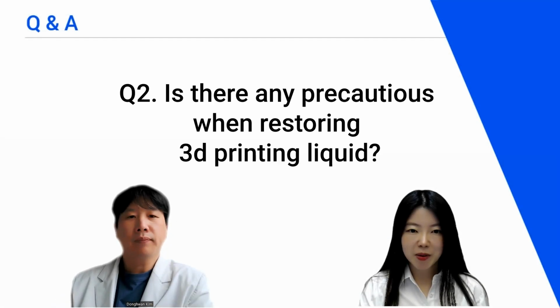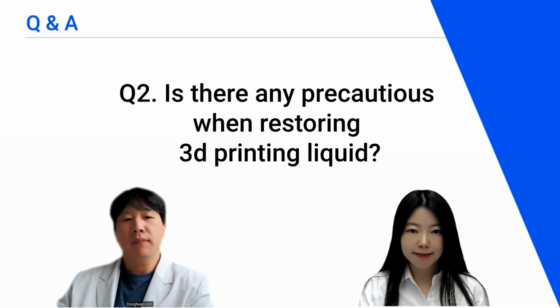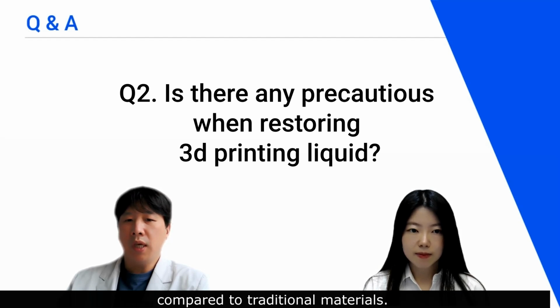Okay, so question number 2. Are there any precautions when restoring with 3D printing resin? When restoring with 3D printing resin, especially those intended for dental prostheses, it's important to handle them with care due to their different properties compared to traditional materials.